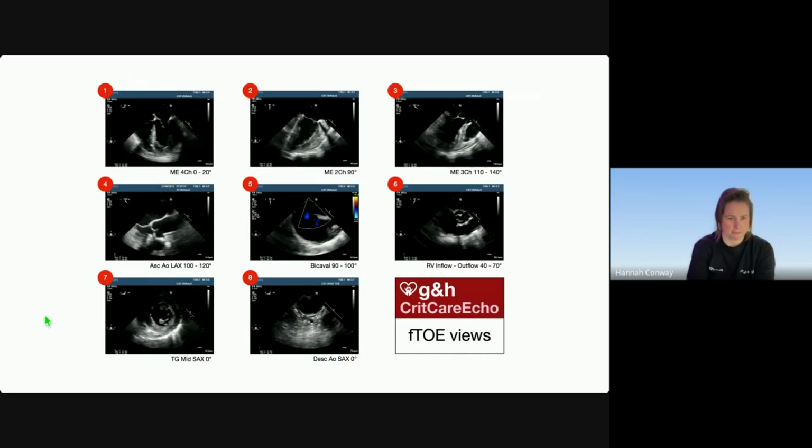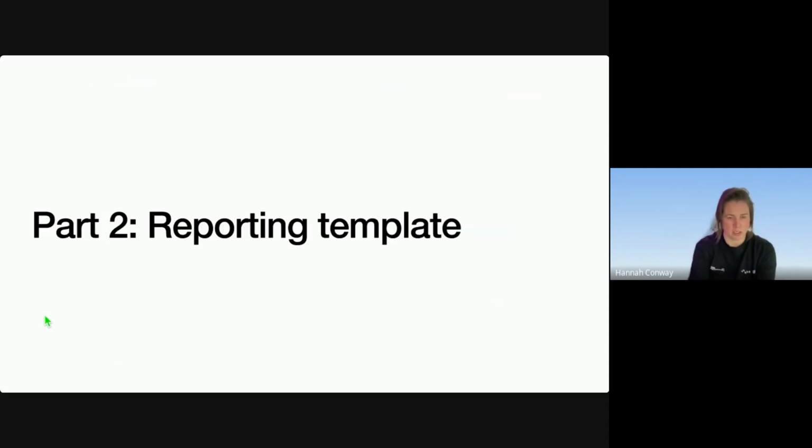So focused TOE views done. That's hopefully a nice refresher for those who are doing it, but also for those who might be viewing it for the first time. That's what's expected of you for focused TOE. So the second part of this, in the time we've got left, I'm going to hand it over to you. I've prepared a case which is quite interesting, actually. And I know it's not always people's cups of tea to get involved, but there's quite a small group of us, so do get involved because it'll test your interpretation.